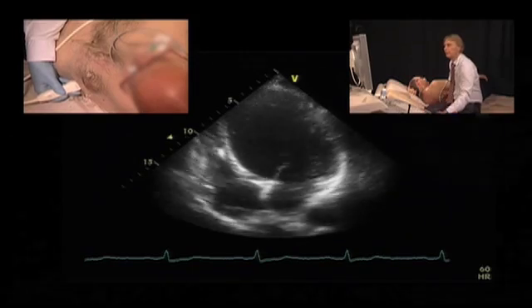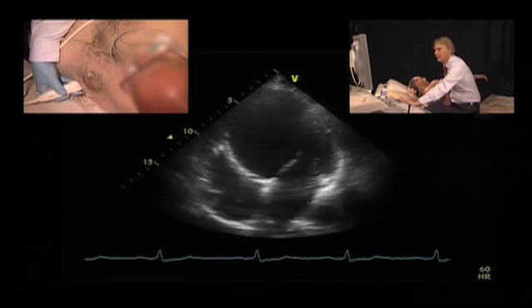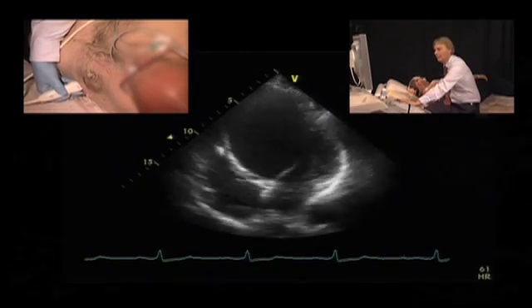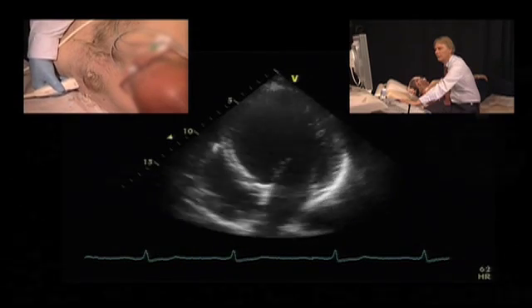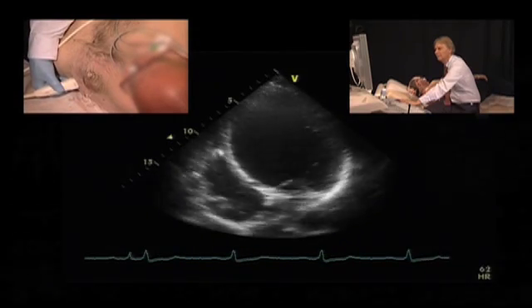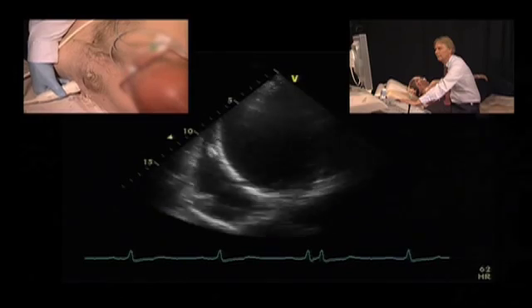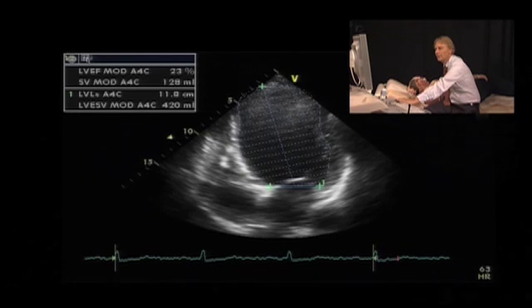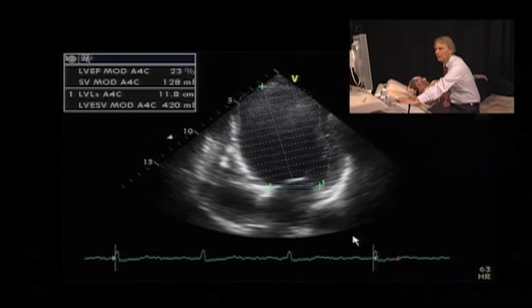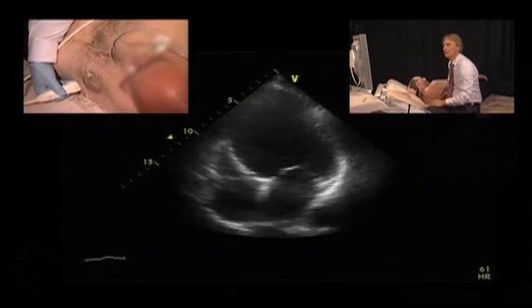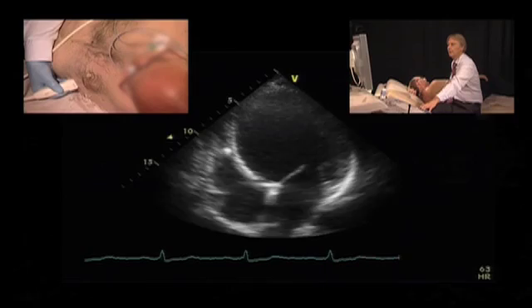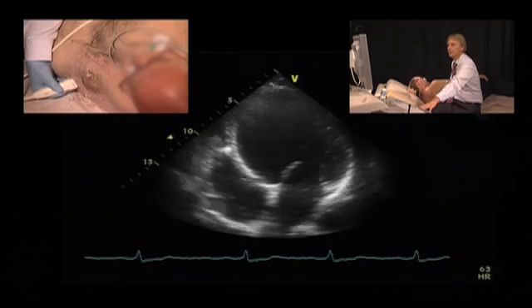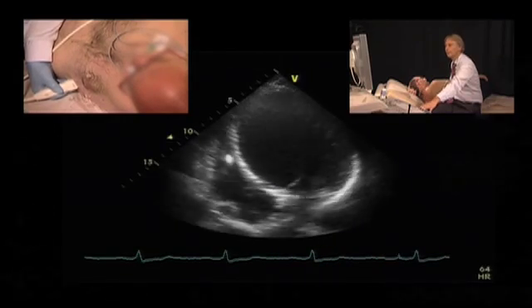Let's go back to the four-chamber view, and then we would also calculate the end systolic volume. By doing so, we would get an ejection fraction of 22-23 percent, which correlates quite nicely with the measurements we had from the parasternal position, the M-mode measurements, and also our visual impression of the ventricle.